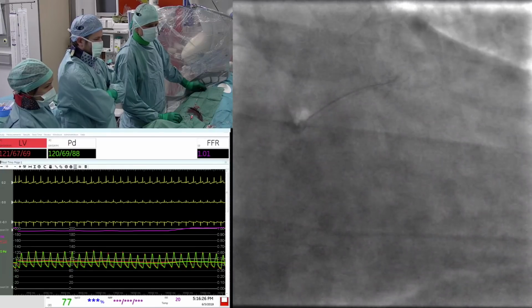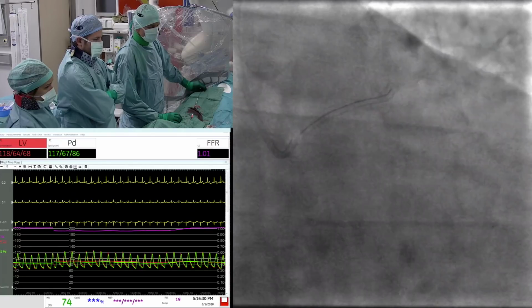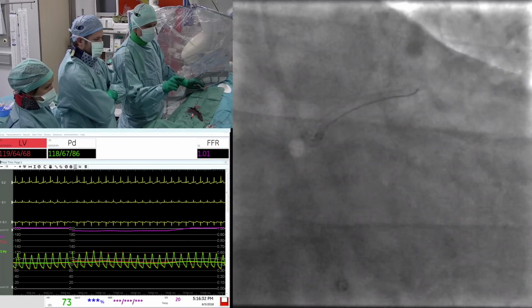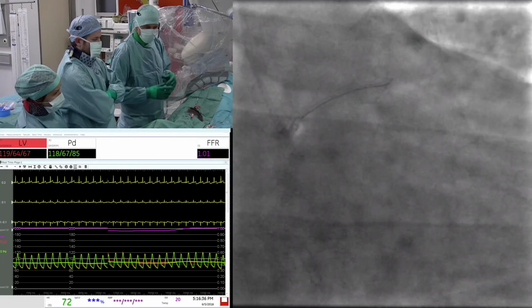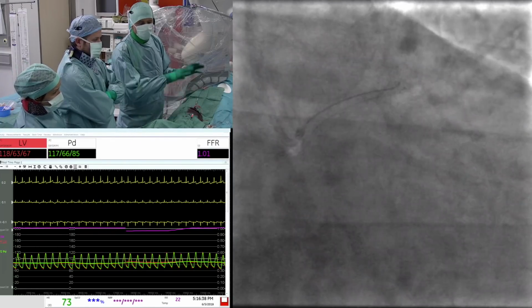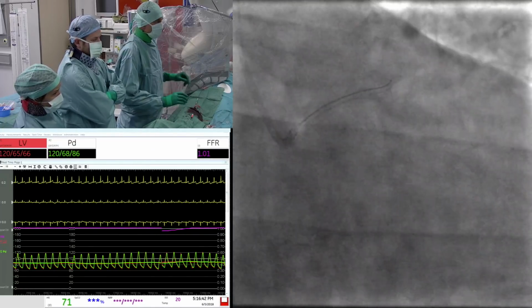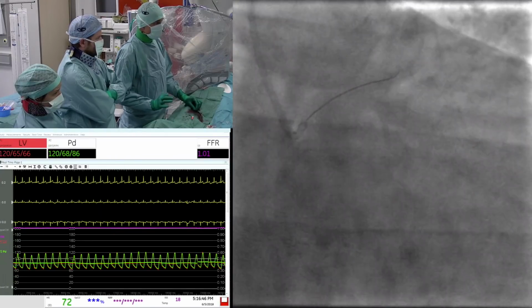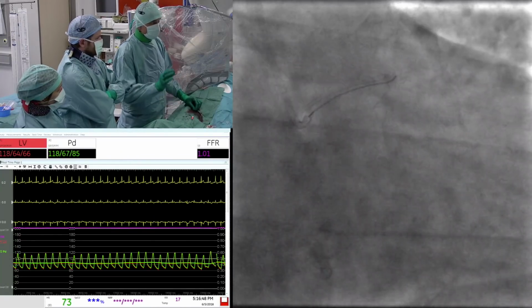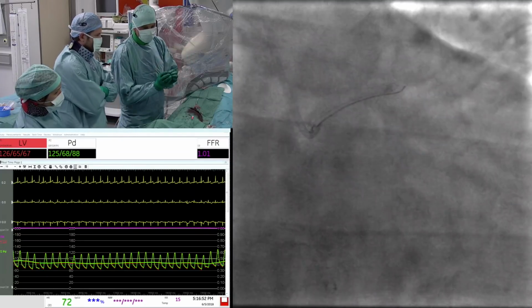very careful with this. Look, I'm going to engage the guiding a little bit in the left main, and you see the morphology which changes a little bit. But even there, even if the morphology is a little bit different, not when we have a complete wedging, of course, you can equalize. Okay, so there is no reason to make it complicated. The only thing which is important when you equalize is to make sure that the two sensors are at the same position and speak the same language.